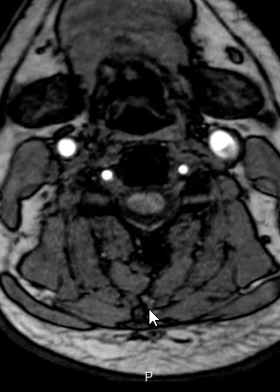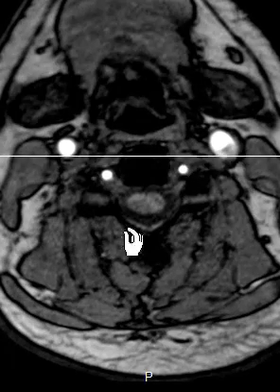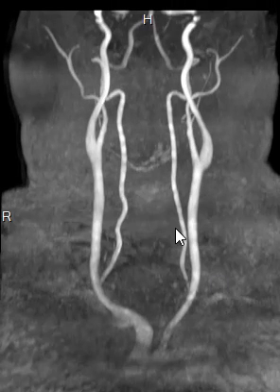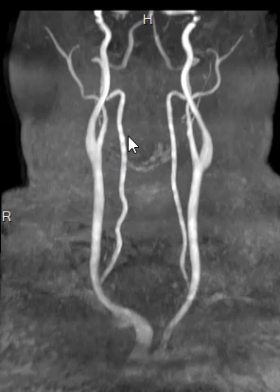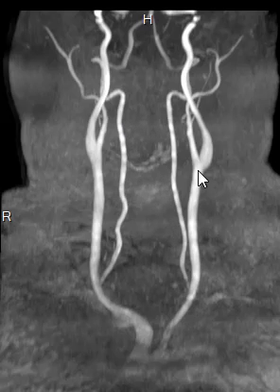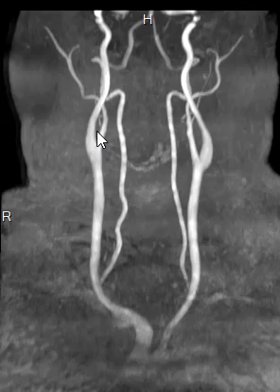Now we can take these images and reconstruct them. These are called MIP — maximum intensity projection — images. We can see the vertebral arteries towards the midline and the carotid systems on the outside.